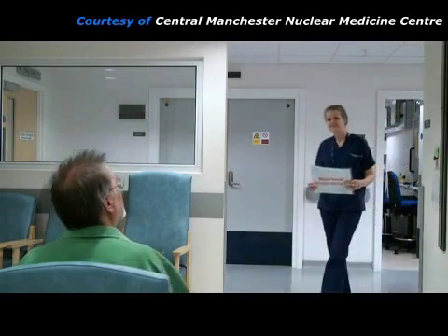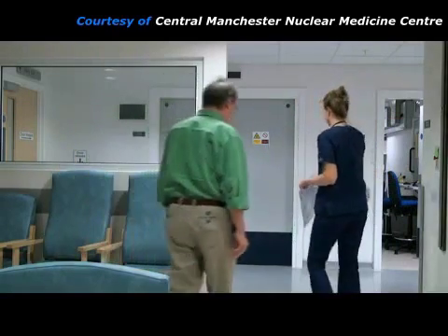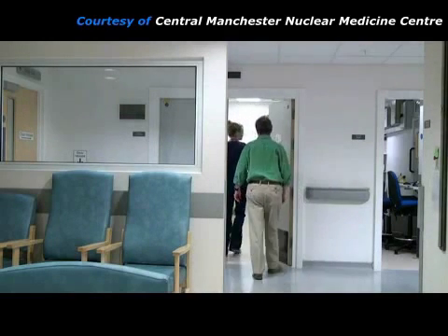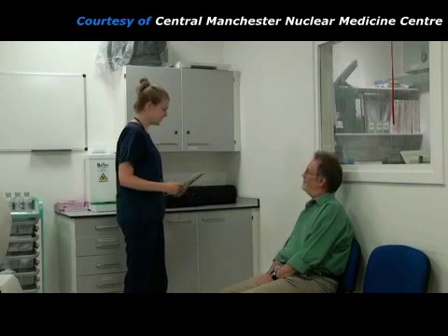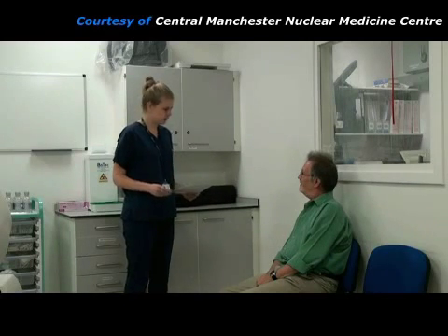This patient is having a myocardial perfusion imaging scan. About 1 hour ago, he was given an injection of a radioactive chemical, known as a radiopharmaceutical, which will have concentrated in his heart muscle. A practitioner takes him into the gamma camera room where pictures of his heart will be taken. The practitioner checks the patient's identification to make sure she has the correct person, then explains what will happen during the scan.